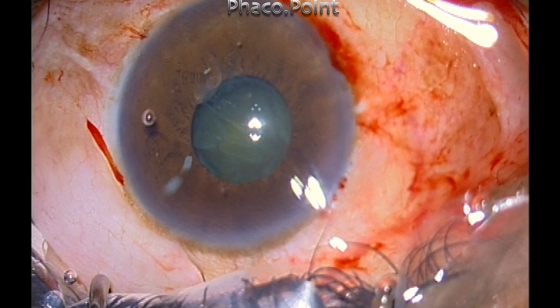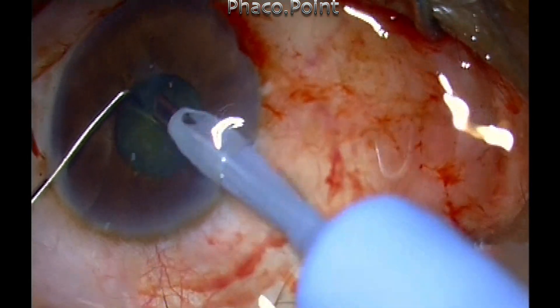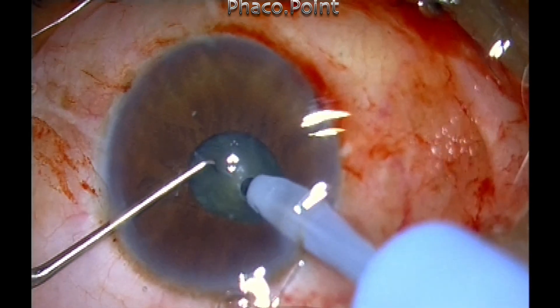The central two millimeter inner circle — the aim of this video is that as long as the phaco probe remains within the central two millimeter zone and as long as you apply power only in this region, then you can safely get by with phacoemulsification even if the pupil is extremely small.